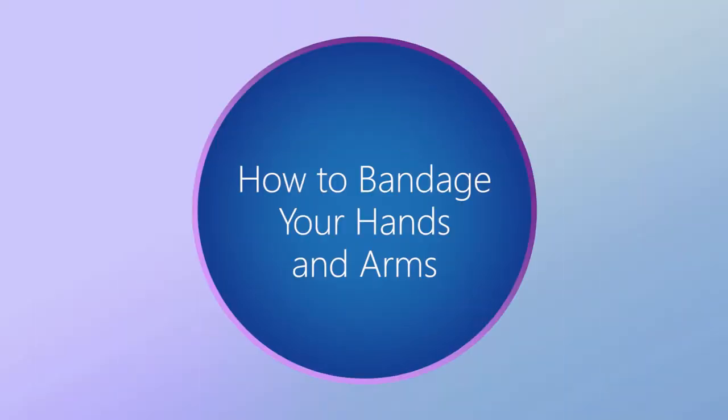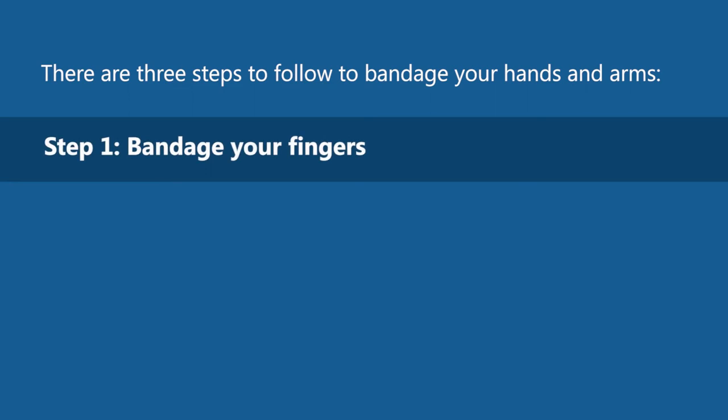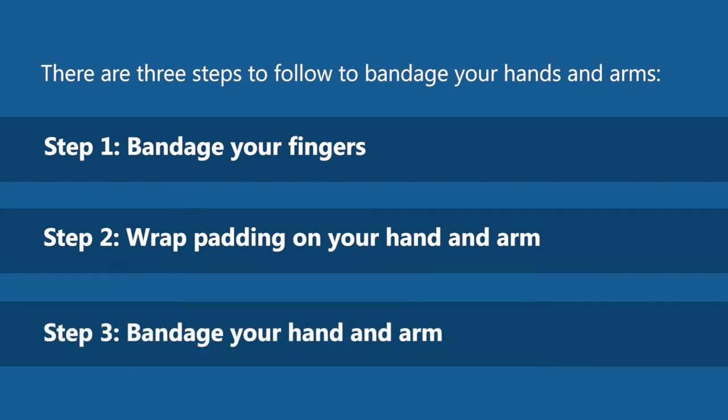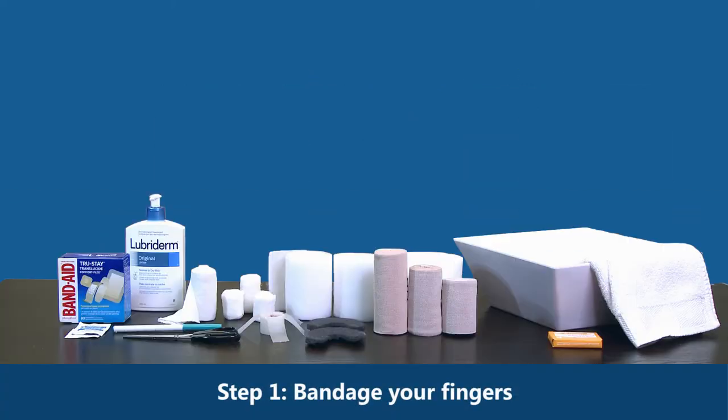How to bandage your hands and arms. There are three steps to follow: Step one, bandage your fingers. Step two, wrap padding on your hand and arm. Step three, bandage your hand and arm. We will now begin Step one: bandage your fingers.